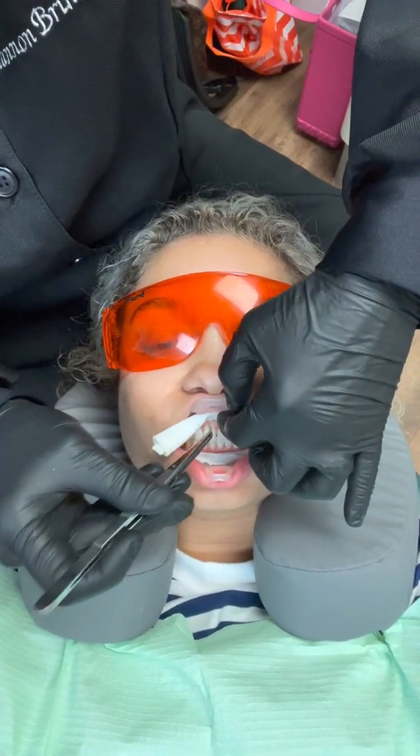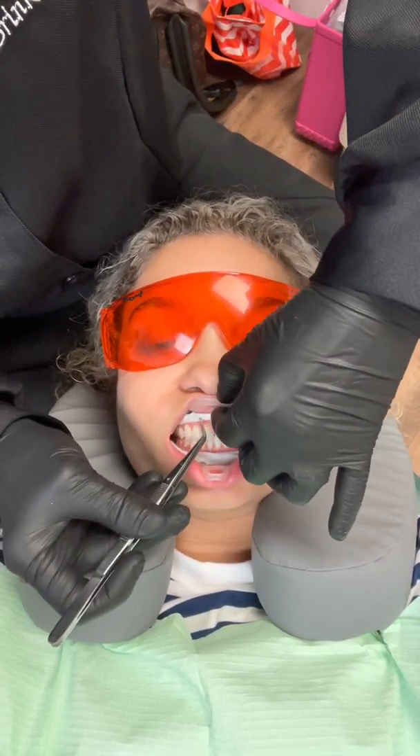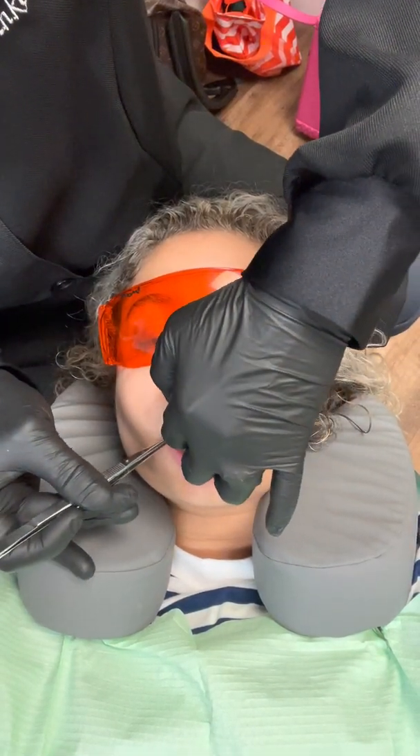What this does is it allows us to help control some of the saliva flow. I actually like the fact that it's pushing the retractor away from the tissue as well. So you can see here I'm just going to put it right up underneath — I'm doing it really because I want to make sure that as the patient talks, which sometimes they do, the barrier stays placed and we don't have any issues.